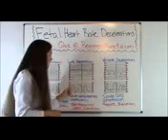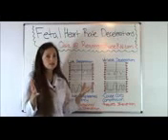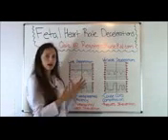But always remember that mom's having a contraction, baby's heart rate's not responding at all, it's staying at baseline, and then after mom's contraction's over, that's when you have the dip, and it keeps going like that.